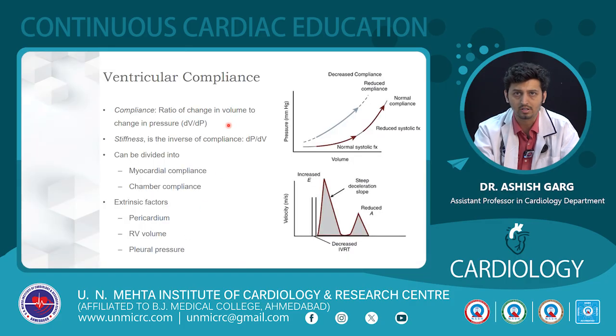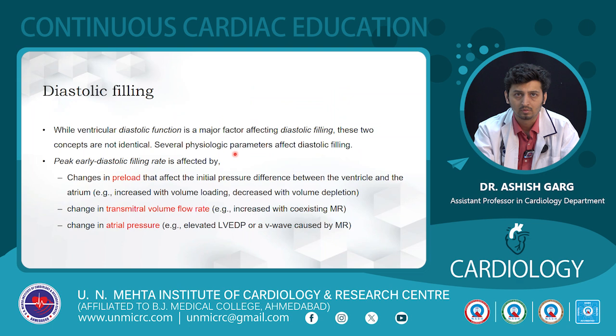Compliance is the ratio of change in volume to change in pressure, and stiffness is the inverse of compliance. While ventricular diastolic function is a major factor affecting diastolic filling, these two concepts are not identical. Peak early diastolic filling rate is affected by changes in preload that affect the initial pressure difference between the ventricle and the atrium. This is increased with volume loading and decreased with volume depletion.